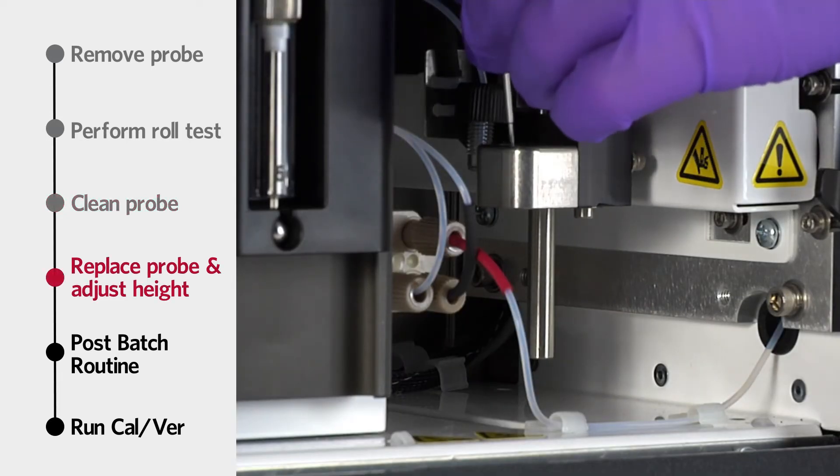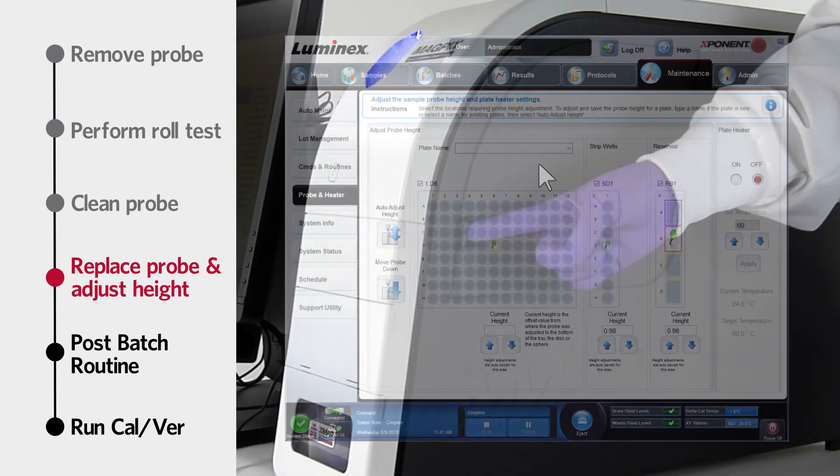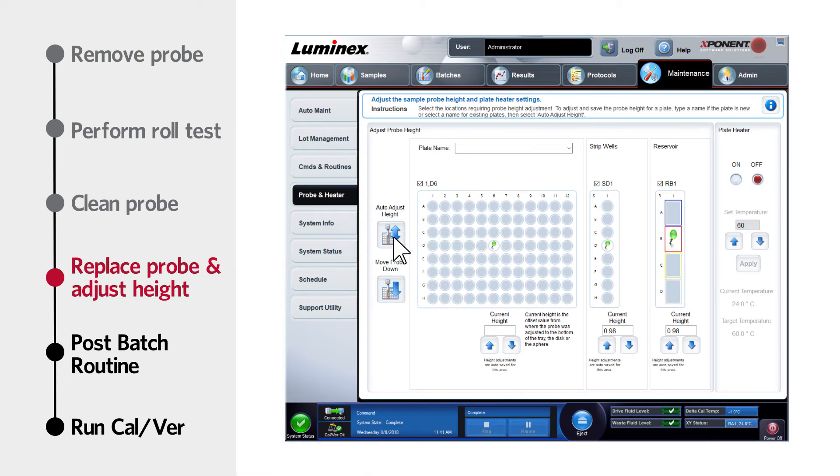Replace the sample probe, tighten the cheminert fitting until you hear an audible click, and adjust the sample probe height using the exponent software.